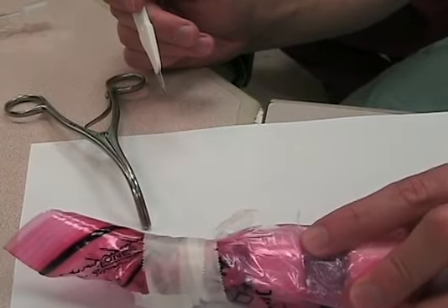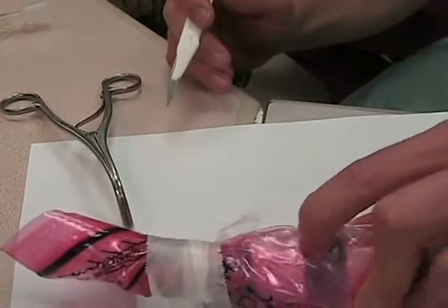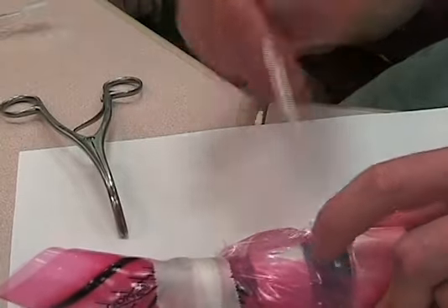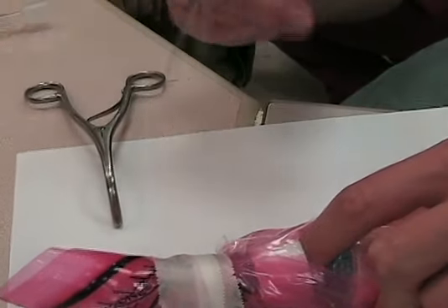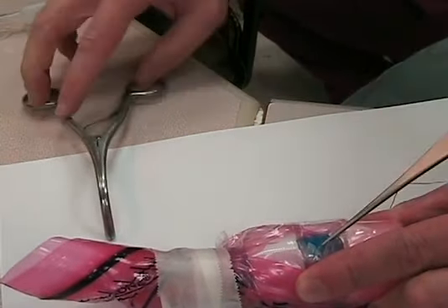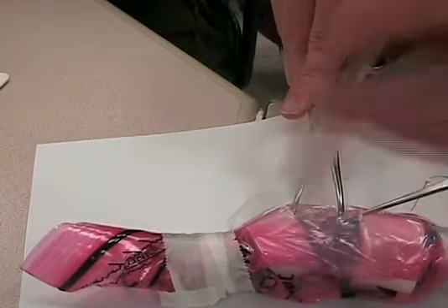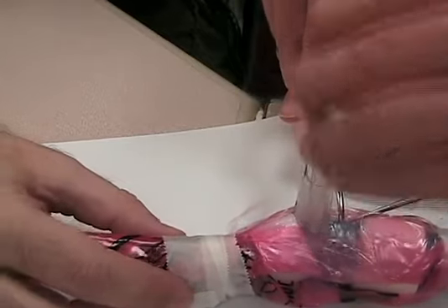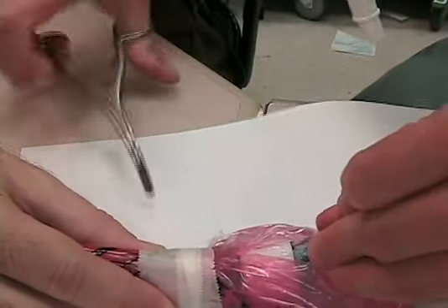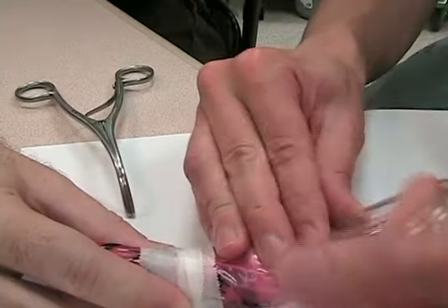Grab onto your thyroid, feel the membrane, skin incision, find the membrane again with your finger, cut the membrane, finger, hook facing towards the ceiling, hand it off, dilator. Now if you don't have a trach, just use an endotracheal tube — same thing. Go in horizontally, not towards the feet, but towards the actual jaws of your trousseau. Rotate the trousseau, rotate your tube, and advance. Don't go any further than when you see the cuff of the tube disappear, or else you'll be right mainstem. You'll have a huge amount of tube sticking out.